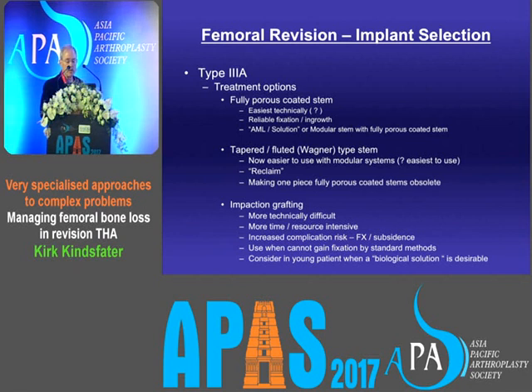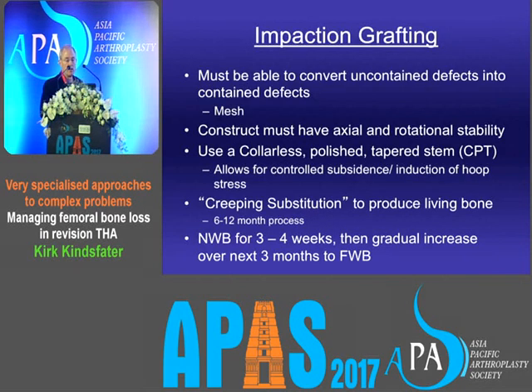But you can use it when you can't gain fixation by standard methods. You can consider it in a young patient, it's actually a biological solution of a sort because we're increasing bone stock. A few tips about this: you have to be able to convert uncontained defects into contained defects, usually with mesh. You have to have axial and rotational stability.